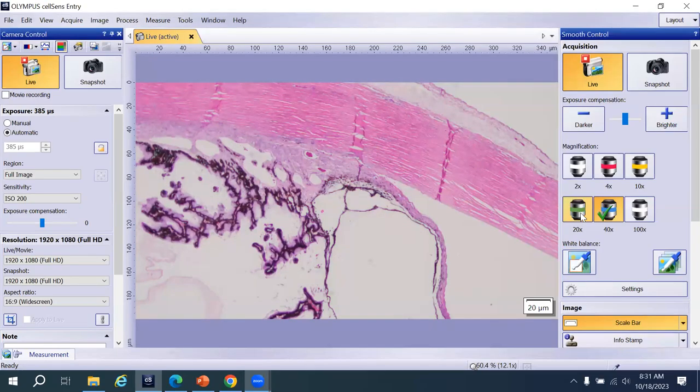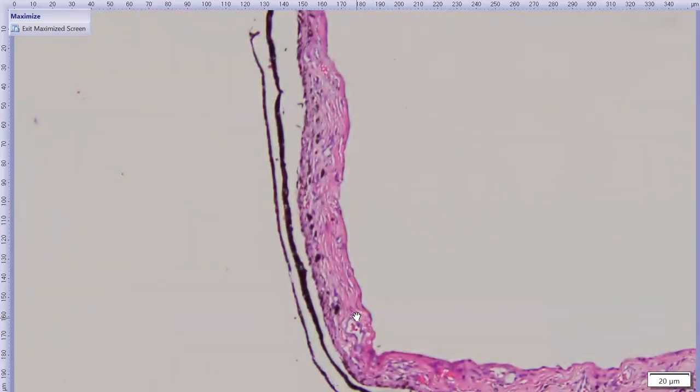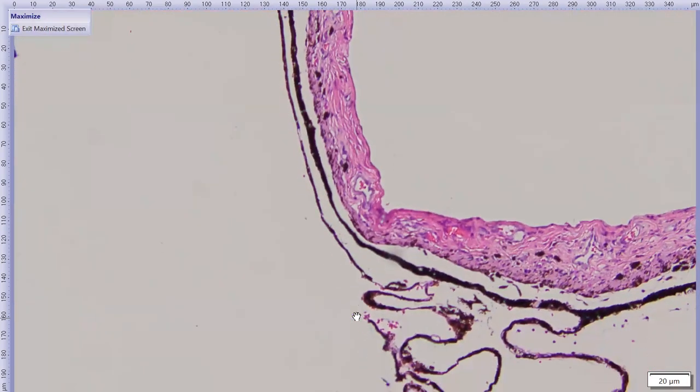Kind of cool. We have a question here. Yeah, go for it. We're asking if we can discuss what caused the darkening of the iris stroma that we see grossly on a microscopic level. I think it's probably what Megan was showing, the markedly thinned iris leaflet on this side and the presence of those heavily pigmented cysts behind.